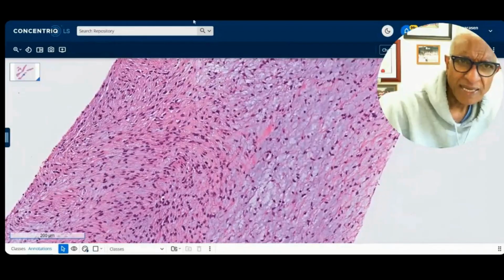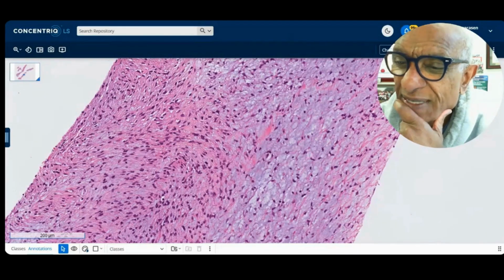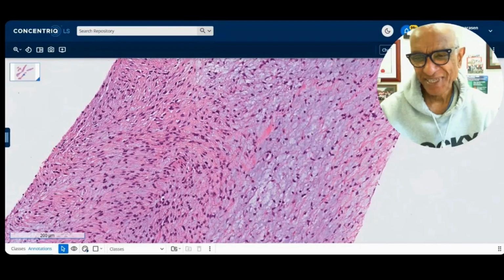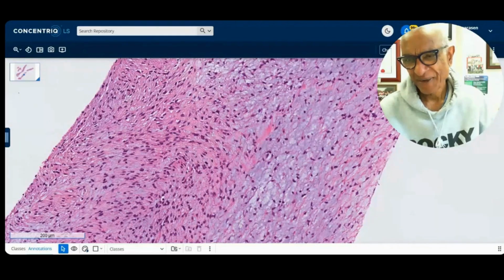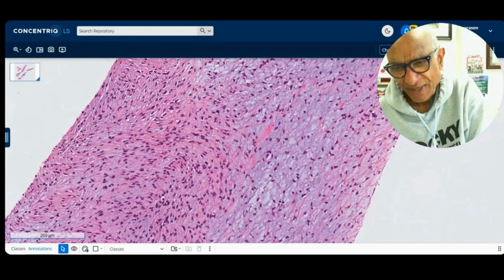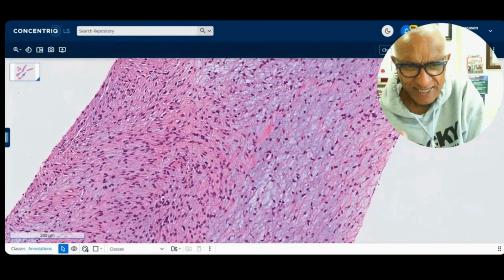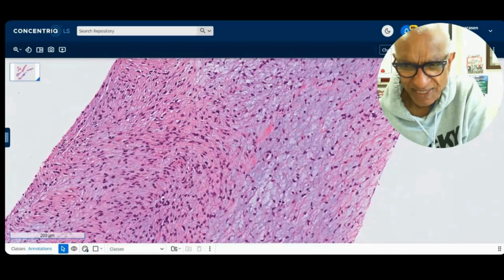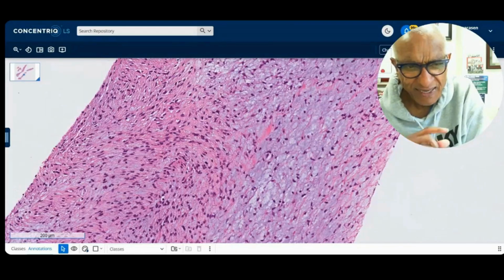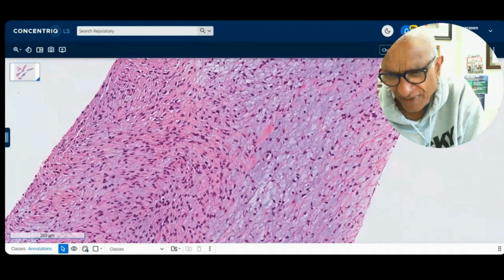Okay, so any questions, comments? I've got to go back to the chat here. Low-grade, yes, that's what it is. I'm glad you mentioned curvilinear vessels, Jan, because curvilinear would be the same sort of arcade that you see, except it has a snake-like appearance. That's where the curvilinear comes in, and we use that to describe the vessels in myxofibrosarcoma. If you were writing up your microscopic description, you'd say with scattered arcades of vessels. You wouldn't use curvilinear vessels. All right, Irene, yeah, that would have curvilinear vessels.